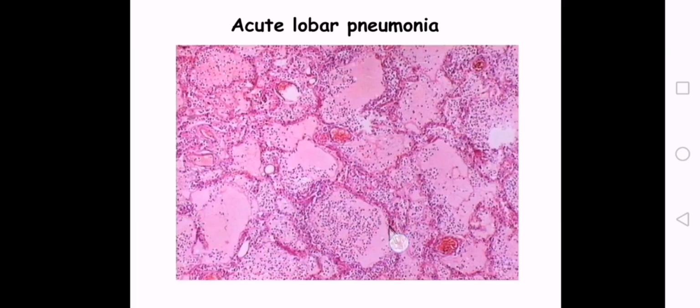Again نفس الكلام، الwall is thickened by edema and inflammatory cells infiltration, few dilated congested blood vessels, والlumen filled with inflammatory exudates, fibrin. هاي البينك amorphous areas هي الفايبرين deposition تشوفوها. هاي كل هاي تؤدي إلى الساينز إلى السيمبتومز أو الكلينيكال برزنتيشن مال النيمونيا اللي هو shortness of breath.